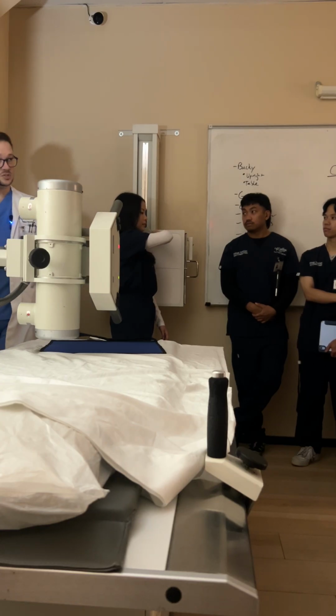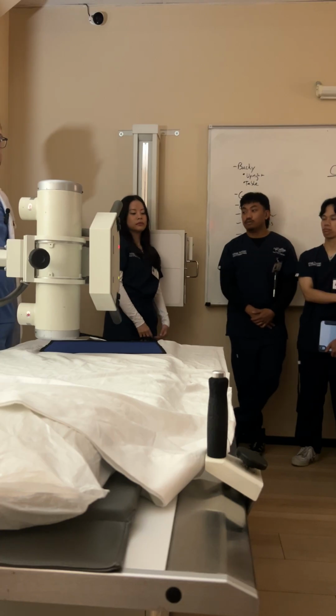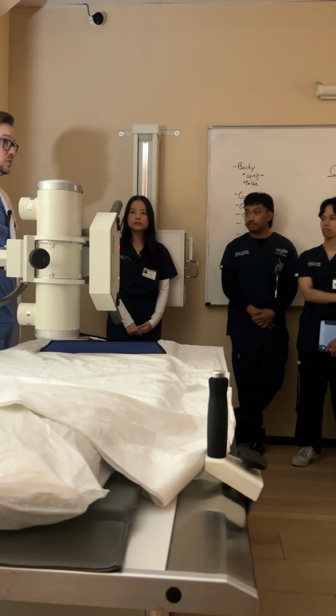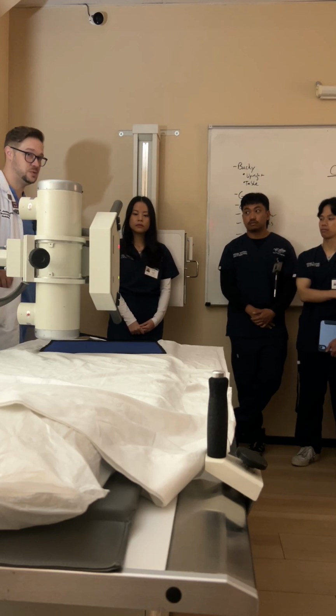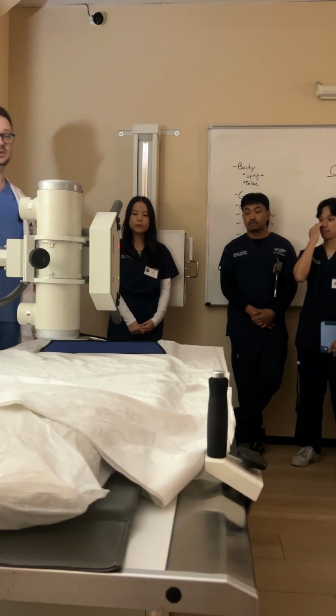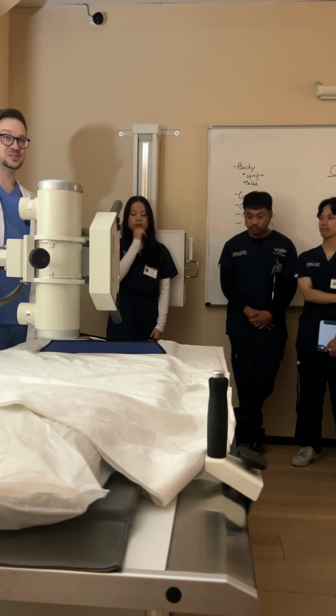Am I going to keep trying to force those shoulders or those arms up as high as they can go? No, because I might hurt her. If she's got osteoporotic bones, I might break something. So we do the best we can. What you will find moving forward is that a lot of X-ray imaging is simply that, doing the absolute best we can in sometimes impossible situations.